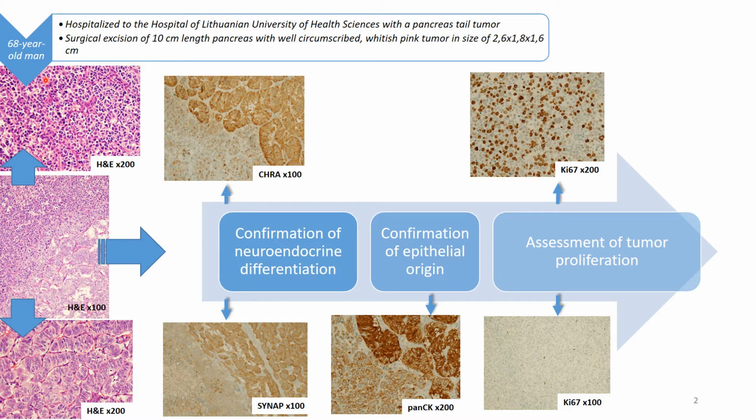And contrary, the other component was formed by highly atypical polymorphic cells that had large nuclei and less cytoplasm. Also, high mitotic activity was seen, and differently, in the well-differentiated part, no mitotic activity was seen. In fact, regardless of the clinical diagnosis, the tumor was suspected to be heterogeneous neuroendocrine.